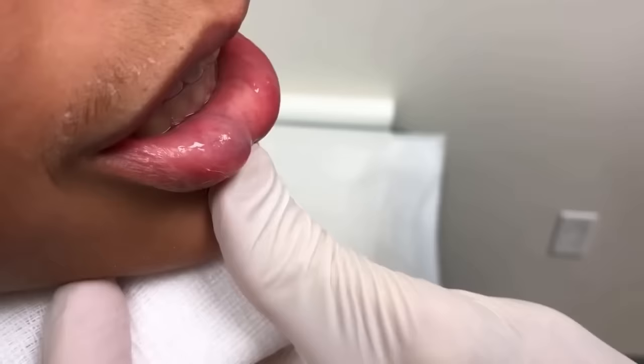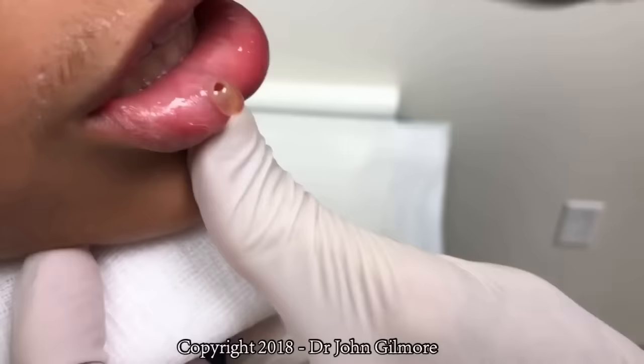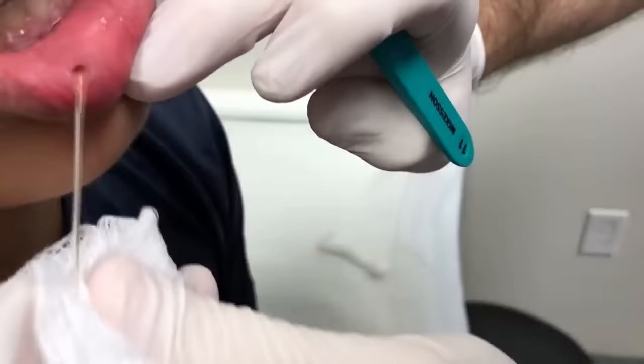Are you ready? Close your eyes, stay real still — think of your girlfriend. Look at that — it's coming right out of there. It's clear. Yellowish clear. Mucus-like. That's why it's called a mucocele. Look at all that.